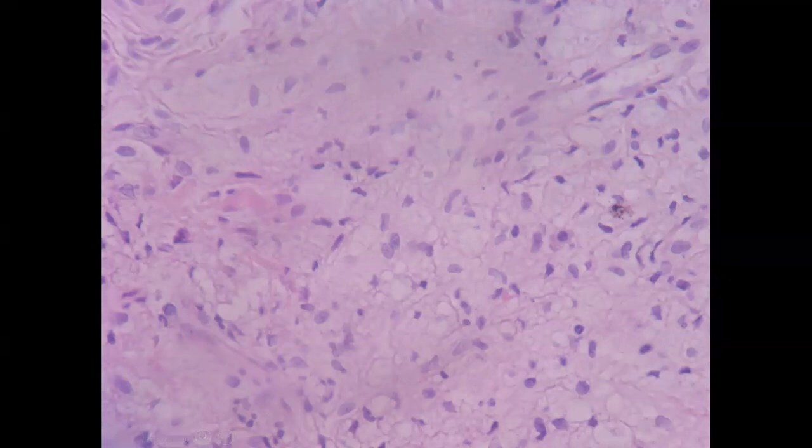Some yellowish tinge is seen in these infiltrated nodules and plaques. These usually heal without scarring, but scarring may be seen. And this is typical of xanthomas. Xanthomas will also have a foamy appearance, but on lepra stain, there will be no Mycobacterium leprae. There will not be any form of granuloma. Some xanthomas are associated with Touton type giant cells.